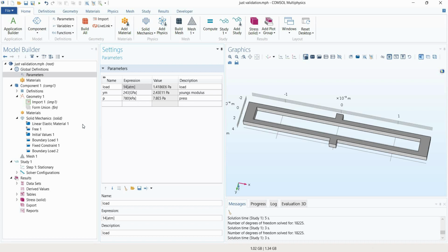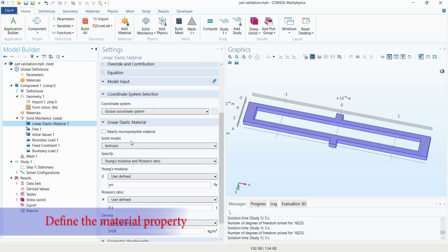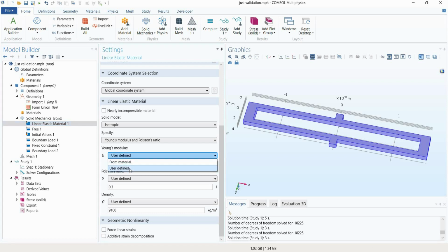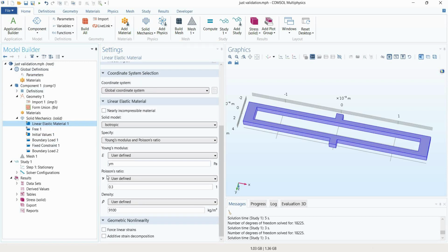Then we just click on linear elastic material property, and here we have to define the material property. The solid model will be isotropic, and then in the Young's modulus section, click on user defined and type Young's modulus, because we have defined it in the parameters, as you can see. And for Poisson ratio just write 0.3, and for density just write 9100.